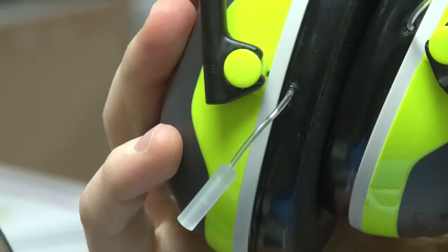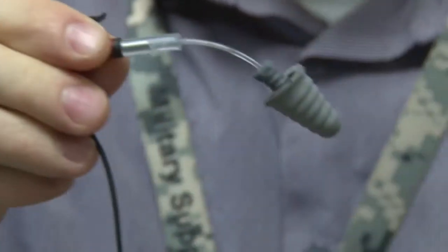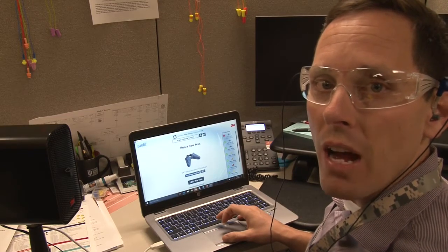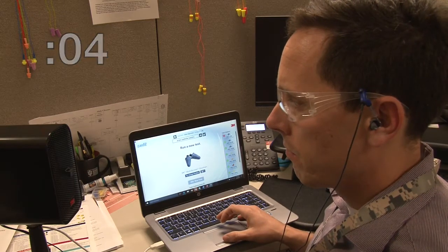You simply have the worker put on the hearing protector with the equipped test probes. You attach the specialized microphones, and they begin the test. After a short blast of noise, the software displays the results within 5 seconds. Good.